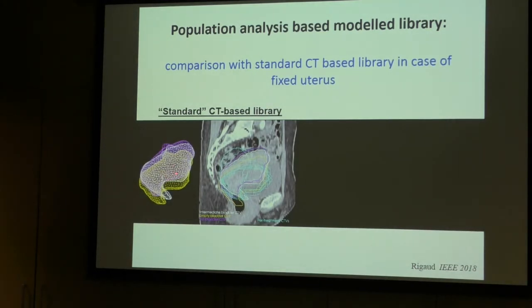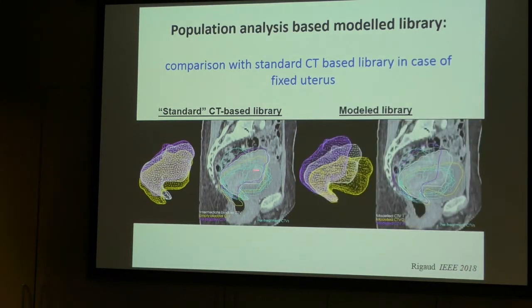Yeah, based on this approach, we were finally able, based on only one CT scan, to generate the uterus motion. You want to comment on that, Oscar? I don't know if I'm very clear.